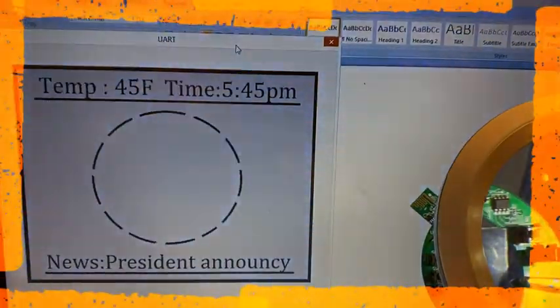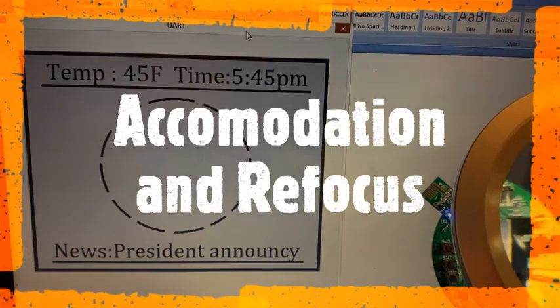And we're going to again demonstrate how it's done. This is a fundamental problem that needs to be solved for AR/VR to be usable and practical and natural in a contact lens. So let us demonstrate how it works. Let me demonstrate how the system works.